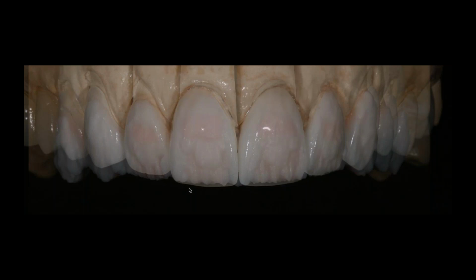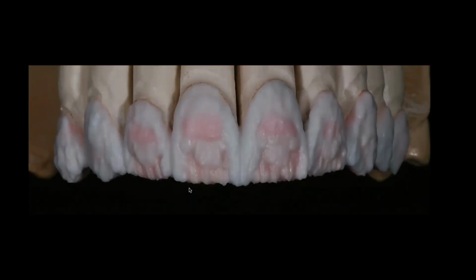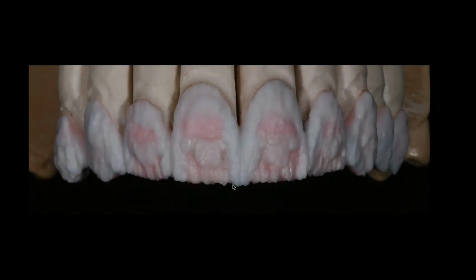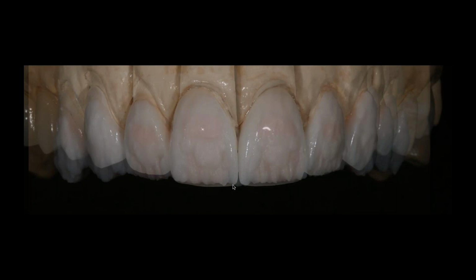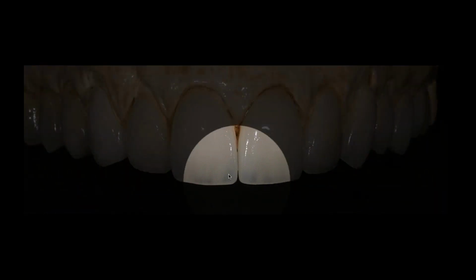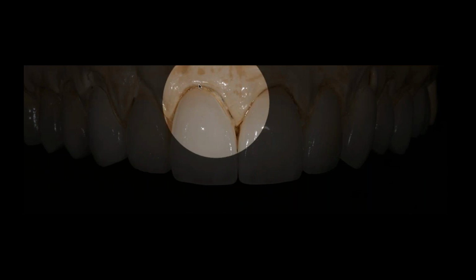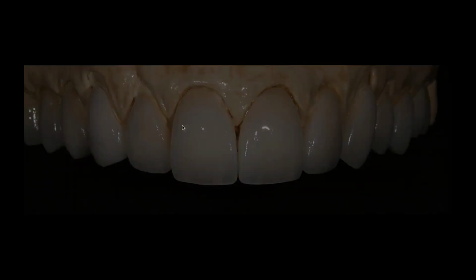And if I join these two together, watch what happens. So let's go back again. I'm going to just walk through that slide one more time. Chroma, value, mammelon materials, and age. I cover that with a very translucent enamel and bond those two together. And you see how all the effects tend to work. My enamel is allowing me to see what's in there. It's allowing me to see the brightness, and it's allowing me to see the chroma at the cervical.